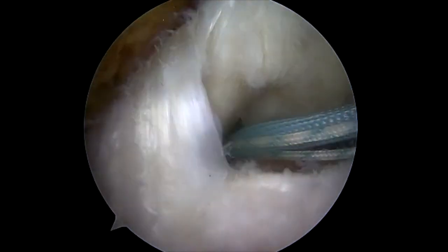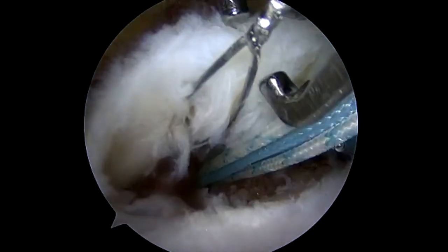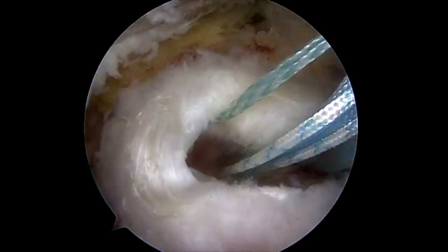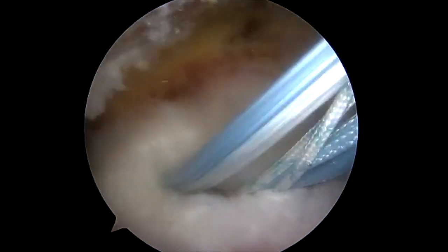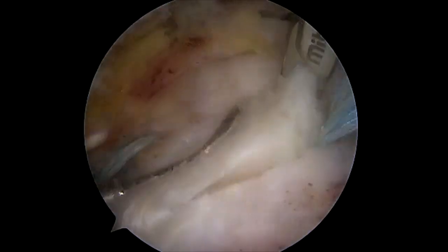Through a posterior portal, an ideal suture shuttle is placed and through it a chia passed. A passing suture will be retrieved, and through that passing suture the tapes and suture will be loaded and passed through the posterior portion of the supraspinatus tendon.